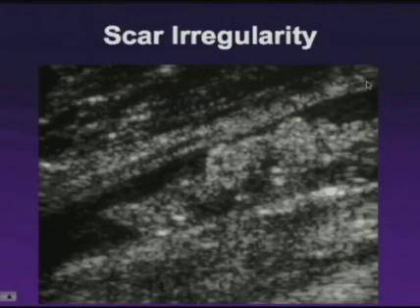In this long-axis view, we can appreciate the fact that the material inside the vein is heterogeneous and perhaps more echogenic than usual. We can see some bright echogenic reflectors inside this scarring as well. But the more striking abnormality is the marked irregular shape of this material inside the vein, indicating that this is a result of the retraction of the material. You can see that the vein itself is normal sized.